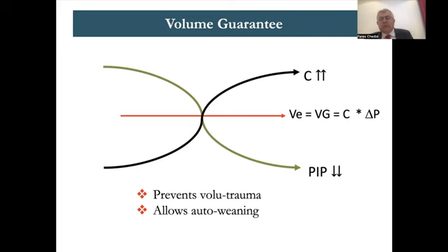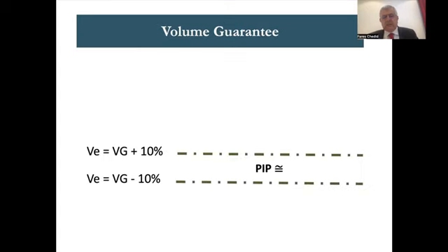We keep the volume always the same in a safe zone between 4 and 8 mil/kg, so we are out of volutrauma. And the patient, as you can see in this picture, will wean himself. He starts at 22, 24 of PIP. After surfactant and whatever improvement he has, you see him auto-weaning until the next day he is at 14, 16, sometimes over half an hour he's at 16 of PIP, and then it is time to extubate. So this is the advantage of volume guarantee: it prevents volutrauma and allows auto-weaning. We also prevent barotrauma by putting a PIP max that the patient cannot exceed.